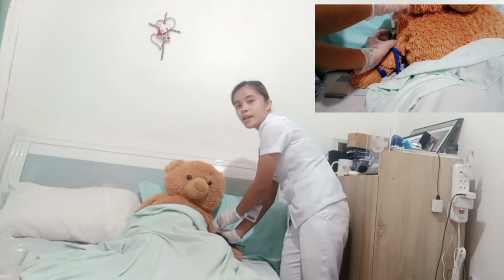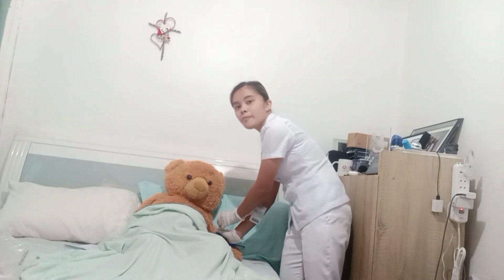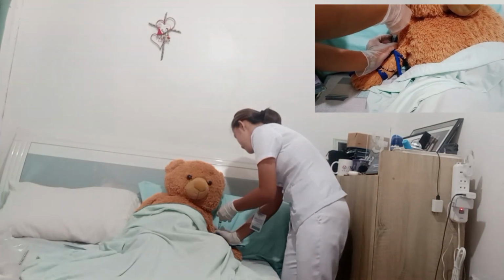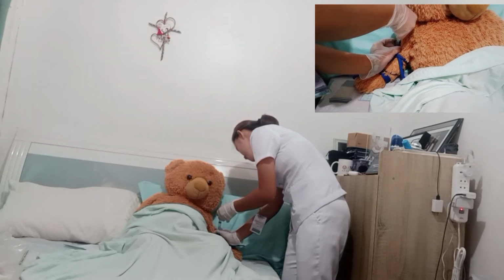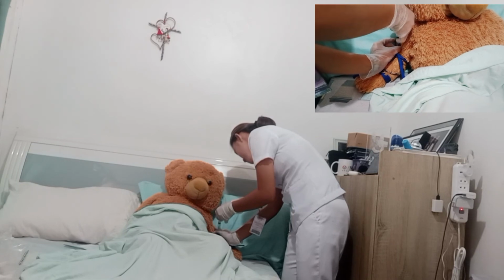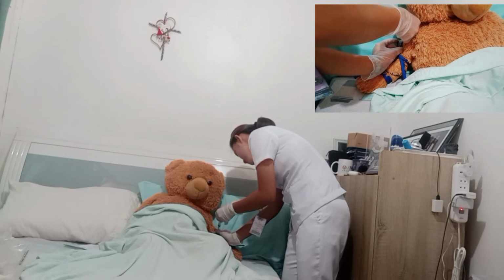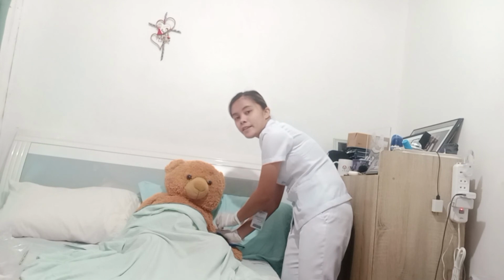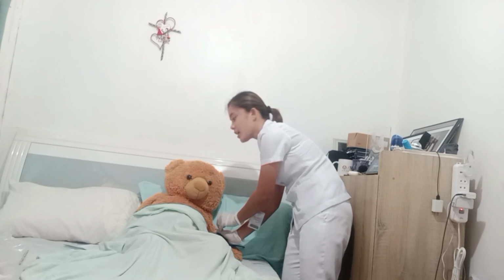Now inject the medication slowly at the rate of 1 ml per 10 seconds, and wait 10 seconds and smoothly withdraw the needle. Now release the skin, place the gauze pad on the site, and apply gentle pressure, but do not massage the area, to minimize tissue damage and patient discomfort.